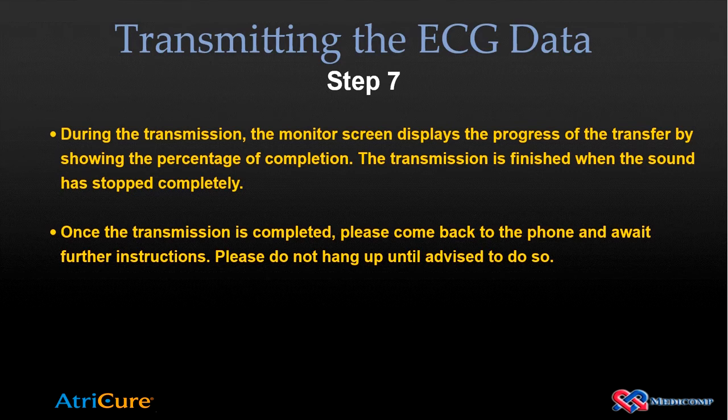Once a recording has been transmitted, the memory space in the monitor is free to store another recording. However, the space is not occupied until it becomes absolutely necessary. In other words, all possible recording memory space is used before transmitted recordings are overwritten. If recordings have not been transmitted, they cannot be overwritten, and the monitor will display an error if the patient attempts to record when the memory has been maxed out.